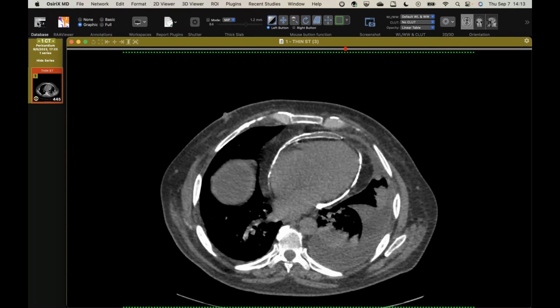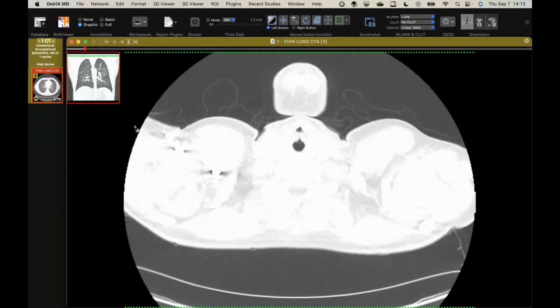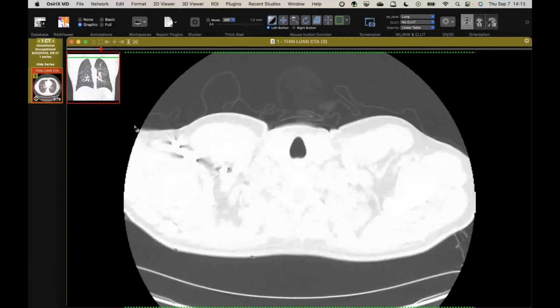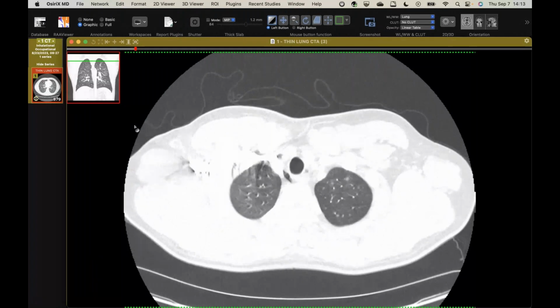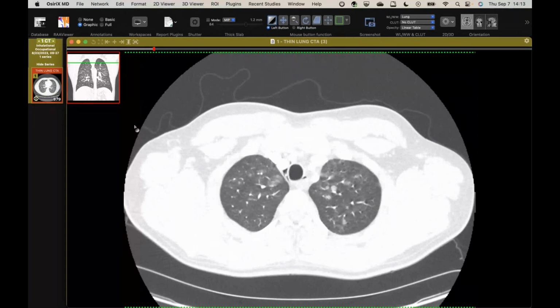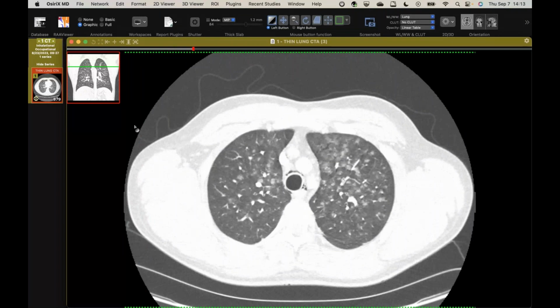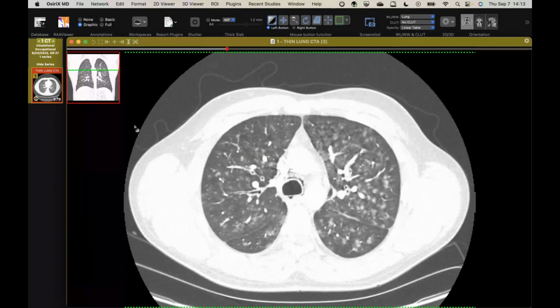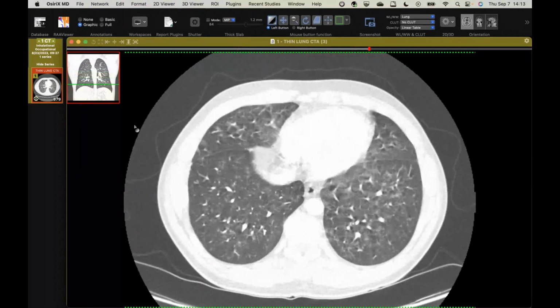All right. This next patient's very interesting. I don't have any pathologic proof, but I have a presumptive diagnosis. So this is a young person who came in to the emergency department short of breath with a little hemoptysis, I believe, over a short period of time, and had this CT here. And you can see there's all these centrilobular, somewhat larger ground glass attenuation nodules. There's some bronchial wall thickening in a pretty extensive amount, and a little bit of septal thickening.